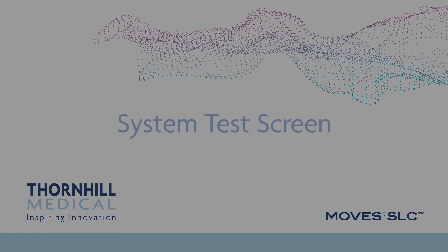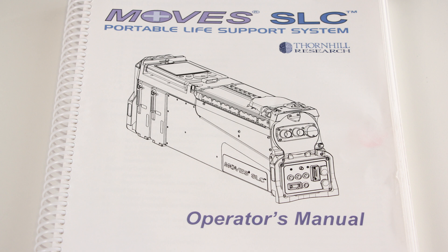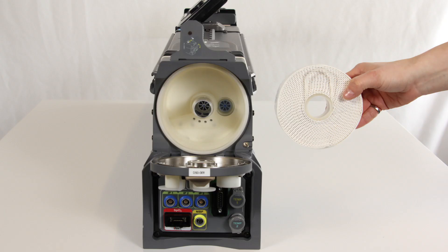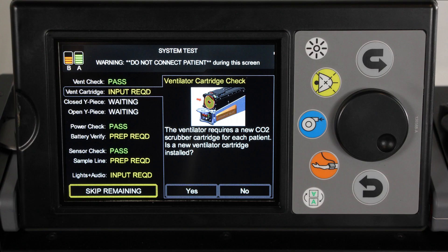System test screen. After you have chosen to configure a new patient, the system test screen is displayed. You are presented with 9 system checks, some of which require operator input. Do not connect any sensors or the breathing circuit to the patient prior to performing system tests. Ensure that the ventilator cartridge has been installed for the system test. Do not operate the MOVES SLC system until all system test failures have been resolved and all tests have been repeated and passed. Only use skip tests if the system test has previously been performed and passed, or the system has just been restarted due to power loss. Some tests including RAM and firmware integrity are automatic.